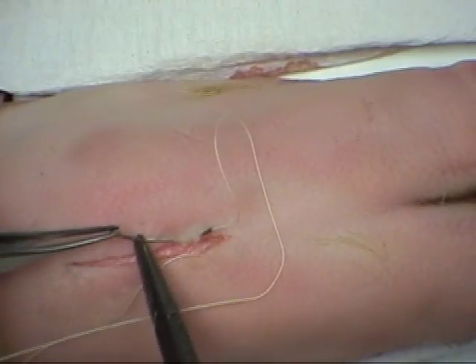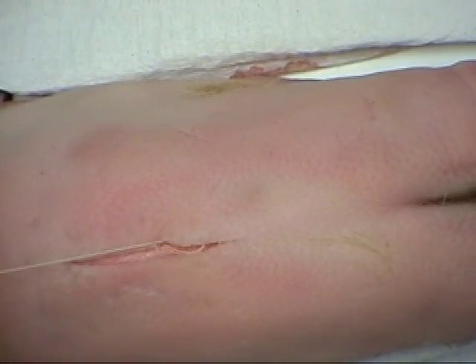The suture is pulled along the line of the incision to close the wound edges.